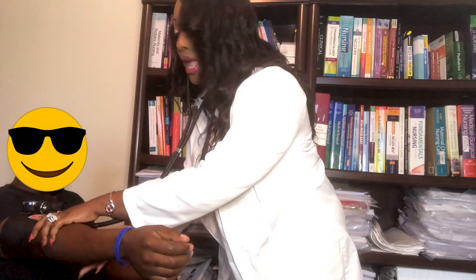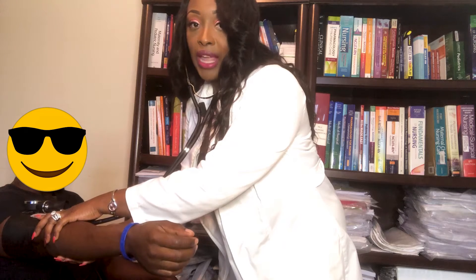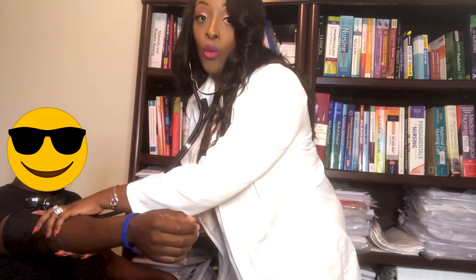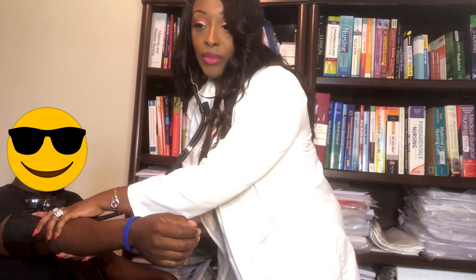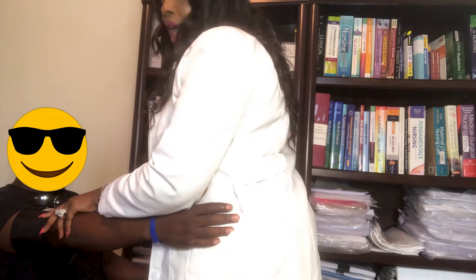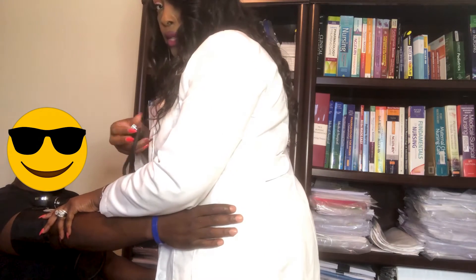You want to support the patient's arm. If they're elderly and can't hold their arm up, what I like to do with my patients is tell them they can place their hand on my hip — go ahead — just to help them out.